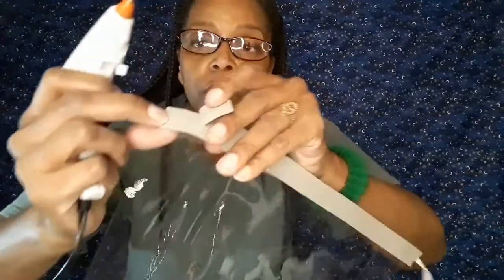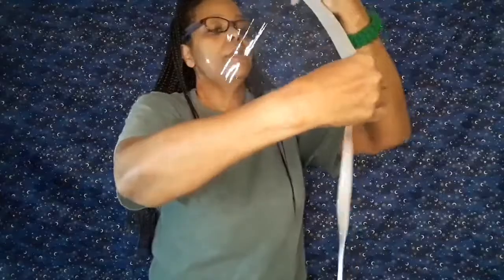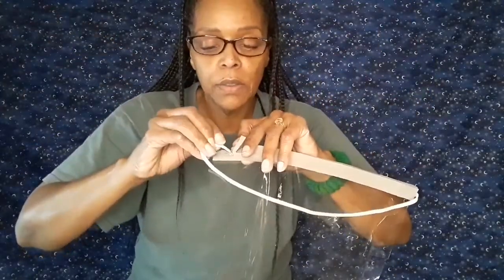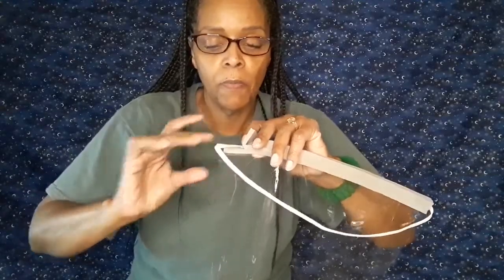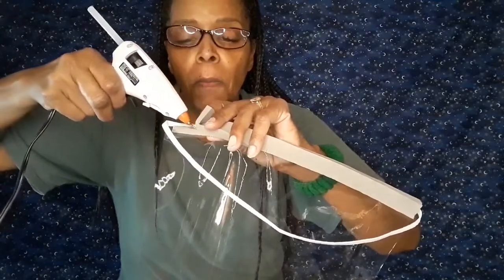I can show this to you real good here. Run that bead of glue. Grab the elastic. Put it down on the glue. Another bead of glue.